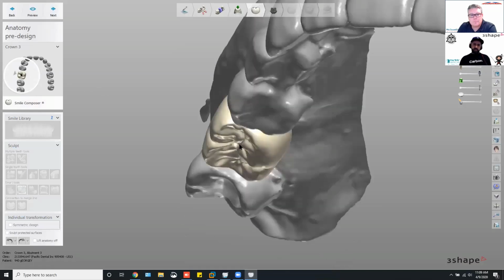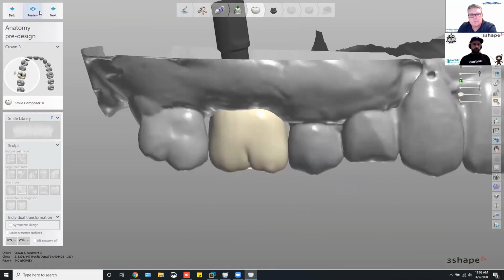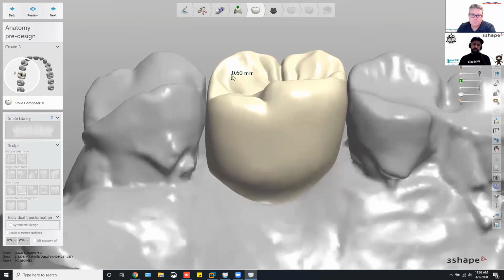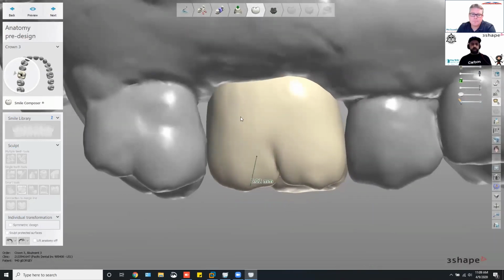But the biggest thing I can say is to take into consideration if it's a hard prep like this one. You can see right here, it comes up to a little point, and I got this opening right here, so we could probably try to fill that. But it's also a lot of communication with the doctor.